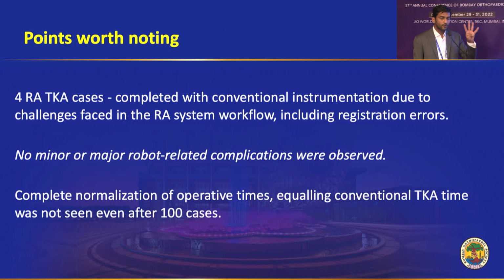Points worth noting: in 4 cases the system went wrong, so I had to convert to conventional. No complications as such were seen in the first 100. And I couldn't really match my conventional times with the robotic system even after 100 cases.